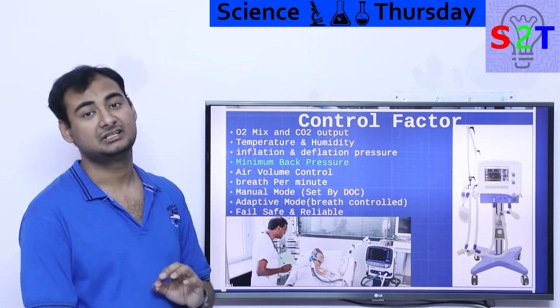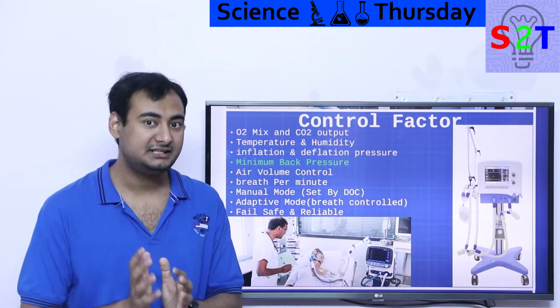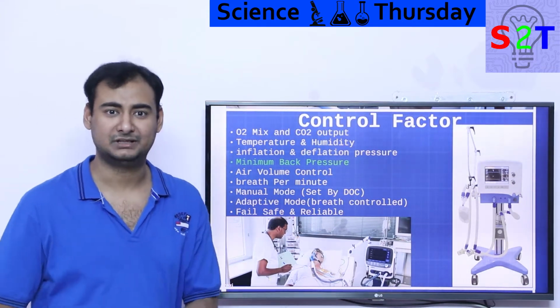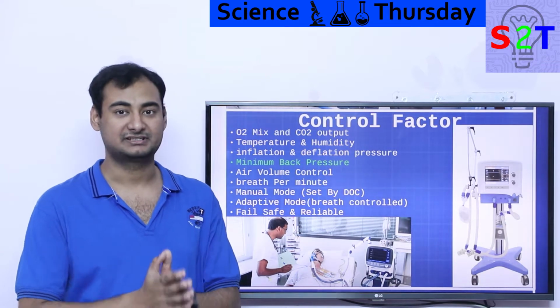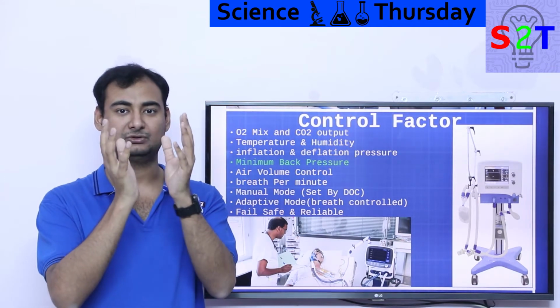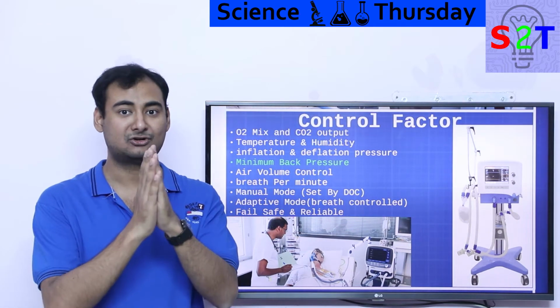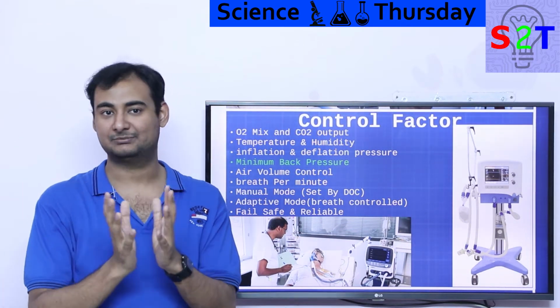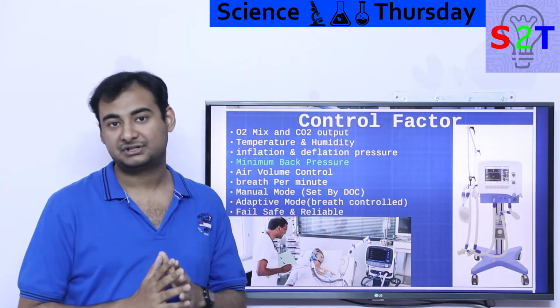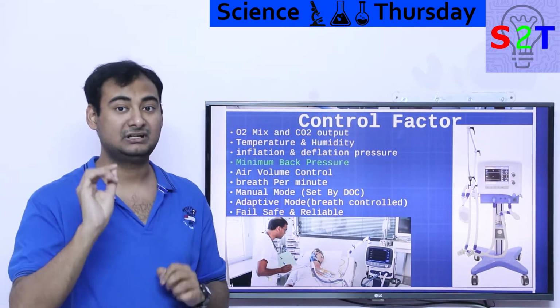And then we come to the most critical aspect in this pandemic: minimum back pressure. Because the infection is directly damaging the alveoli. Actually, it's not damaging them directly; it infects them, and the immune system is blasting it out of orbit. The side effect is that the alveoli are very fragile. So once they get damaged, if you breathe out, because again it shrinks, in its weakened state it could literally collapse. When the collapse happens, you're dead, because your air sac is no longer working. You cannot open it up again, and you cannot blow air in to open it up. You will damage the remaining alveoli more. That is why minimum back pressure is such a critical component right now. You want to exhaust, so I'm going to pull the air out of it, but will not let the pressure drop.